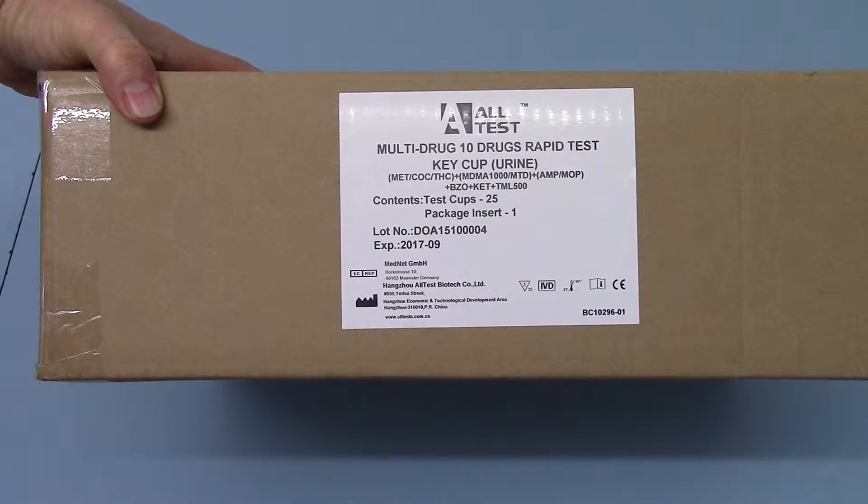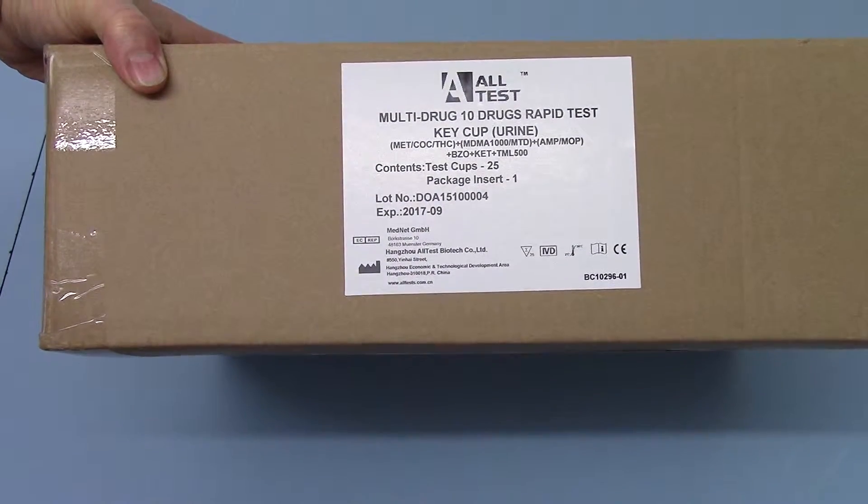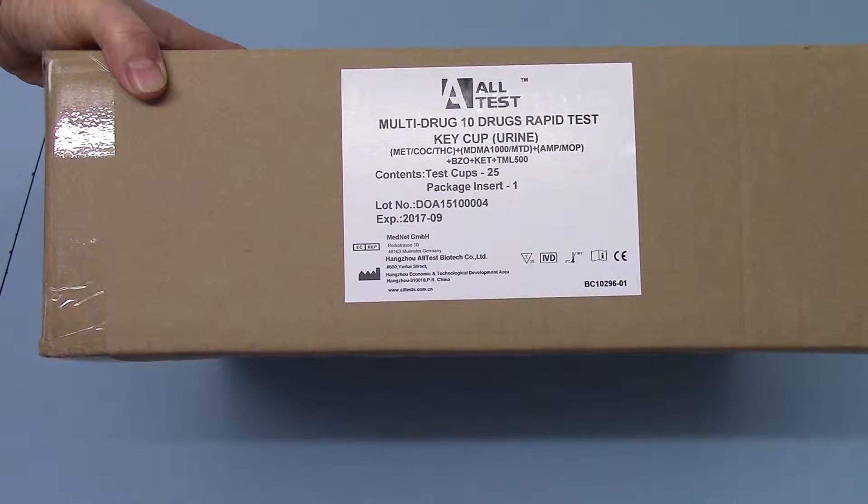which is a 10 panel including methamphetamine, cocaine, cannabis, MDMA, methadone, amphetamine, opiates, benzodiazepines, ketamine, and tramadol at 500 nanograms.